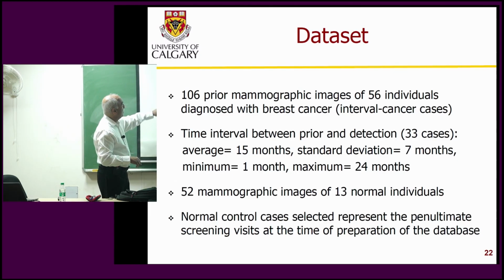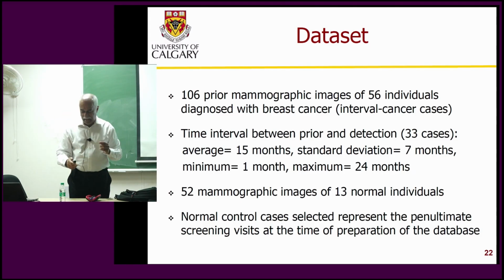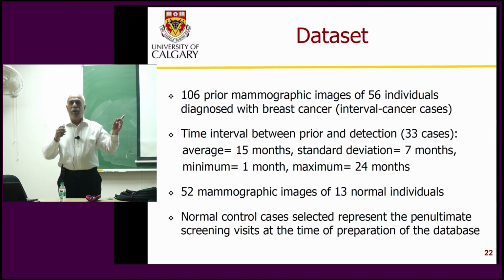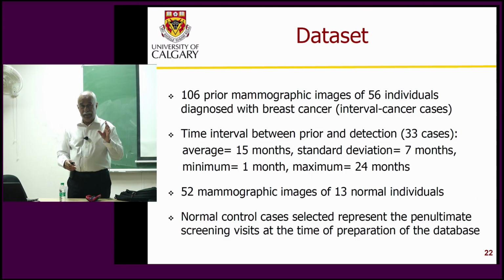The problem is, for these prior mammographic images of women with breast cancer, there is no reference. But Dr. Desautels did a rather difficult task: regions of interest were marked where he estimated the cancer to have had some signs at that time, from the reports from the diagnostic clinic as to where cancer was found. So he had to look at the image, and perhaps the signs were very poor because they were missed by 2 radiologists in the screening program.